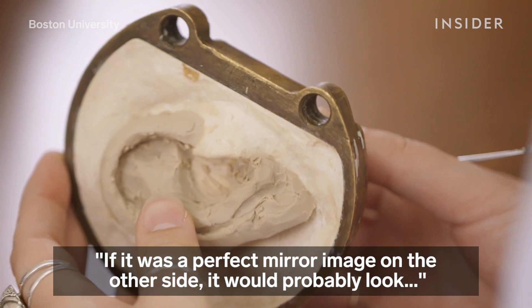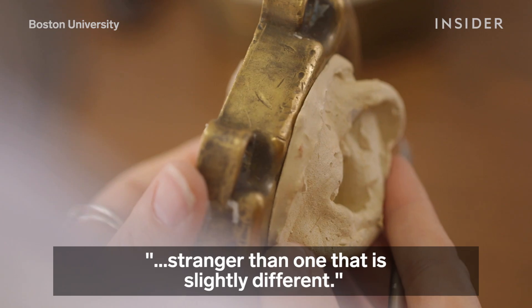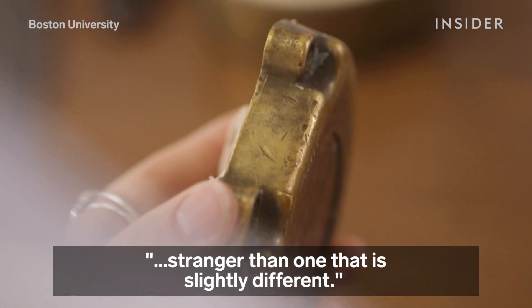If it was a perfect mirror image on the other side, it would probably look stranger than one that is slightly different.